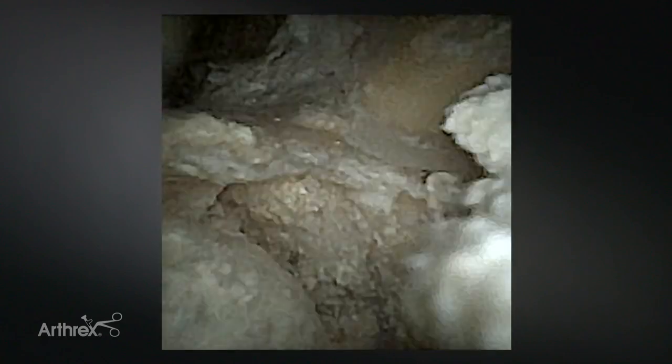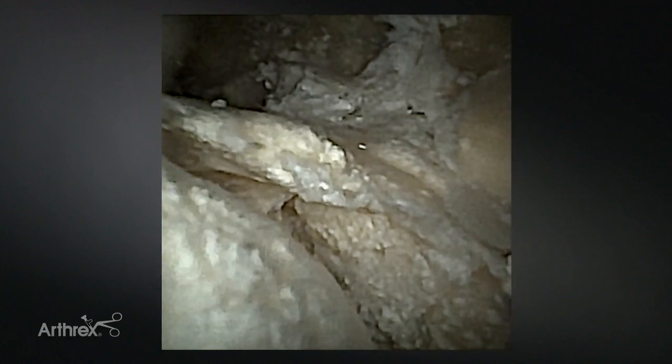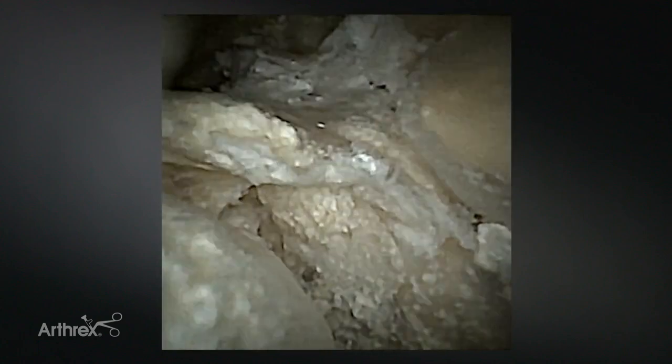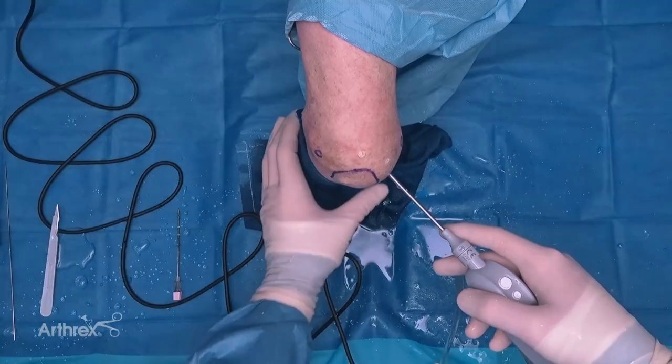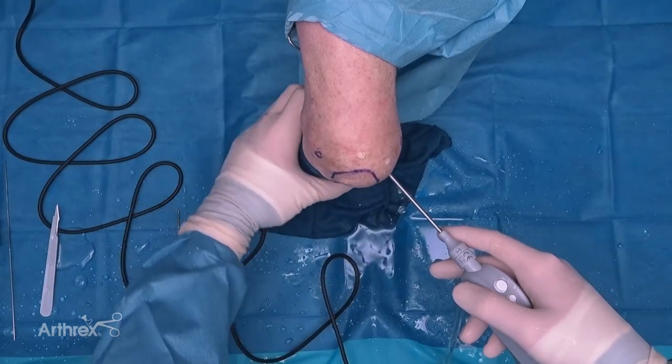I can come through quite easily and into the front of the elbow. Now I'm actually viewing the anterior compartment of the elbow from the soft spot in the back, because the smaller 2.8 millimeter cannula allows me to drive all the way through. This can be helpful when trying to create your anterior portals - you can do this under needle localization rather than trying to do it blindly. One of the things that's unique about the nanoscope is it allows you to view places you can't really see with a four millimeter scope - here I can look in the ulnohumeral joint and actually drive into this joint.